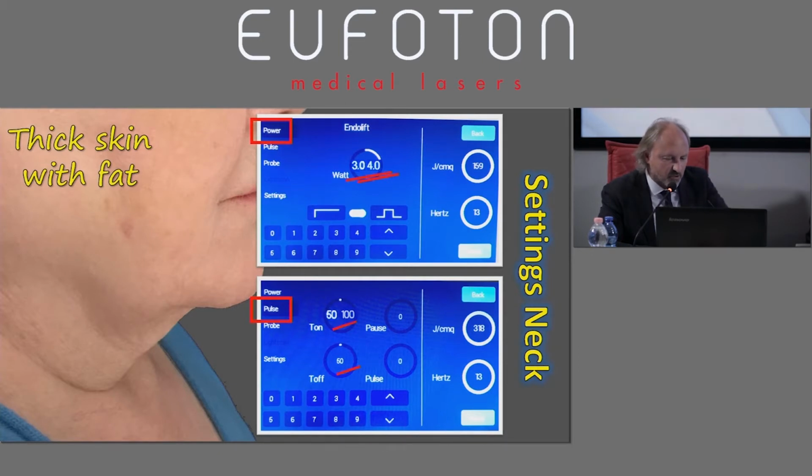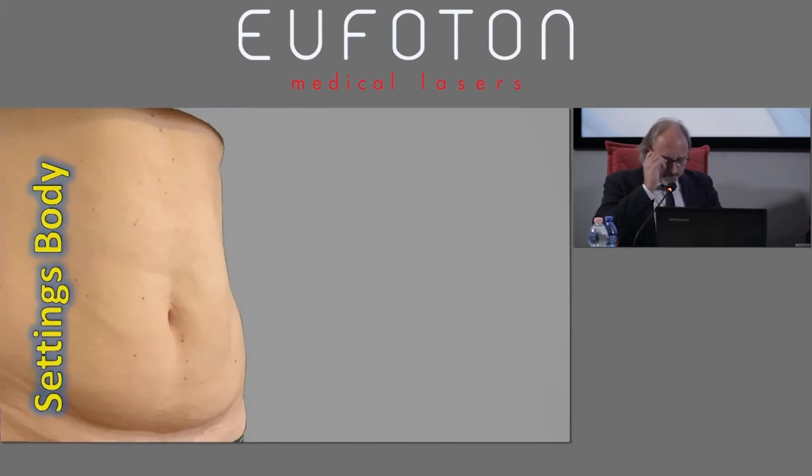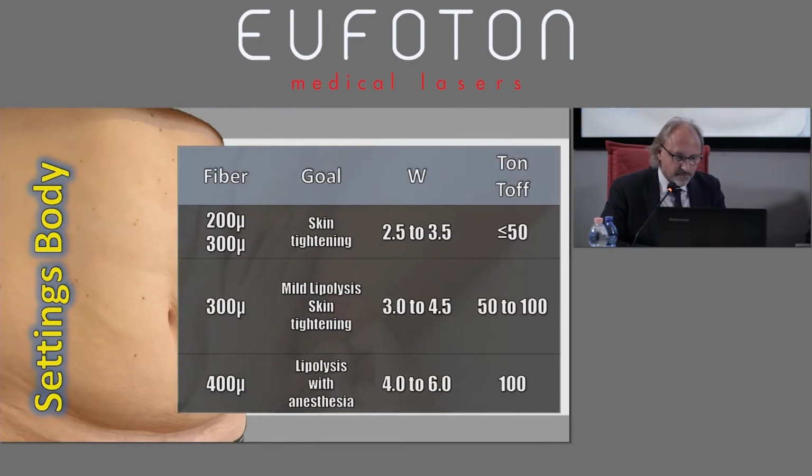situation is different now. I don't remember if I included this slide in my presentation, but sometimes I do some local anesthesia with a small syringe. I just take some oil out, which causes inflammation, and that's something I suggest to all of you. I recommend it also for those who are not surgeons: we have to suck gently and use a very small cannula, like a lipofilling cannula. It's very easy and quickly done. This really helps us because this oily matter also gives rise to some inflammation, extending the recovery time per se.